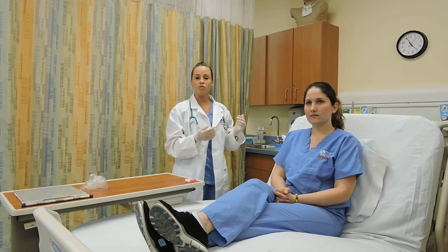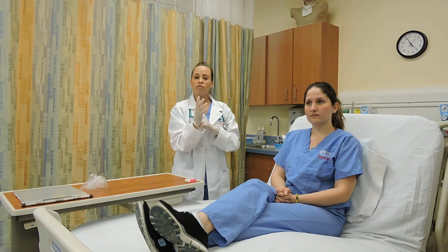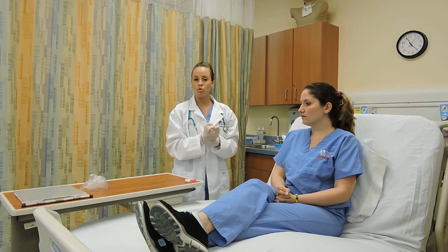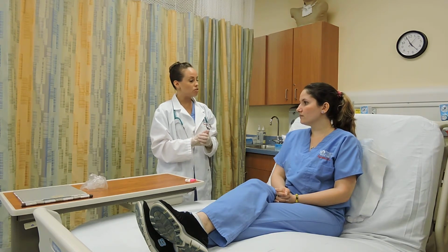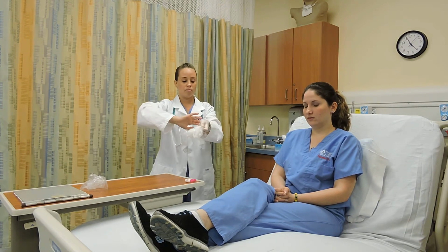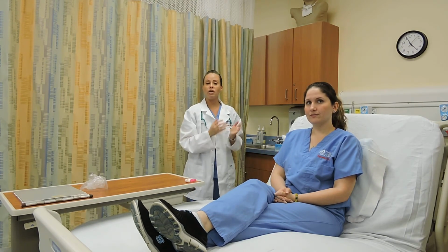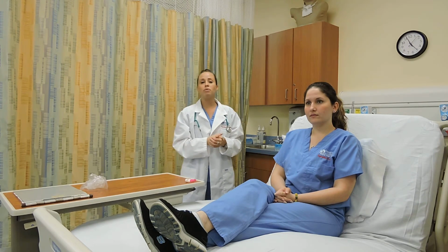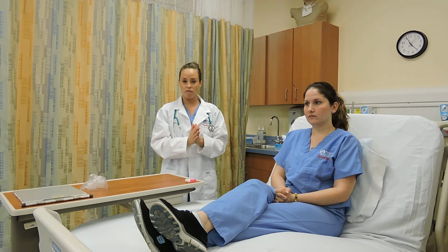Once I'm done with my session, I'll reassess my patient's vital signs to assess the therapy's outcomes. Okay? I'll make sure that my patient is comfortable and I'll ensure her safety. Ms. Sanchez, we're done for today. You did a great job. Is there anything else I can do for you? No, thank you. Okay, I'll remove my PPE, perform hand hygiene by either washing my hands or utilizing the alcohol-based hand rub, and document my therapy's findings in the patient's chart. This has been a video on PAP as an adjunct of bronchial hygiene therapy.